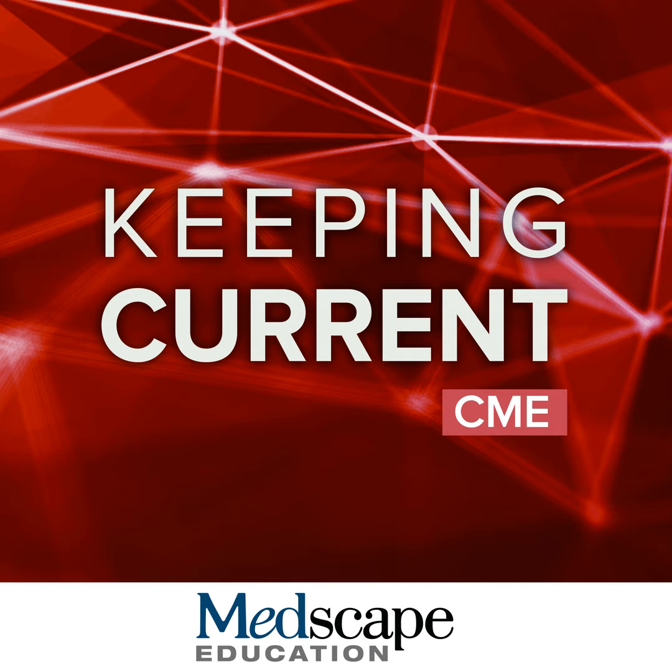Now, on a per patient basis, this means that if a person has multiple lesions, you see one. That's concerning. Can you detect that at least one? On a per patient basis, the per patient sensitivity and negative predictive value is higher than reported for ultrasound, and it provides a similar per patient sensitivity as a complete study with gadoxetic acid.